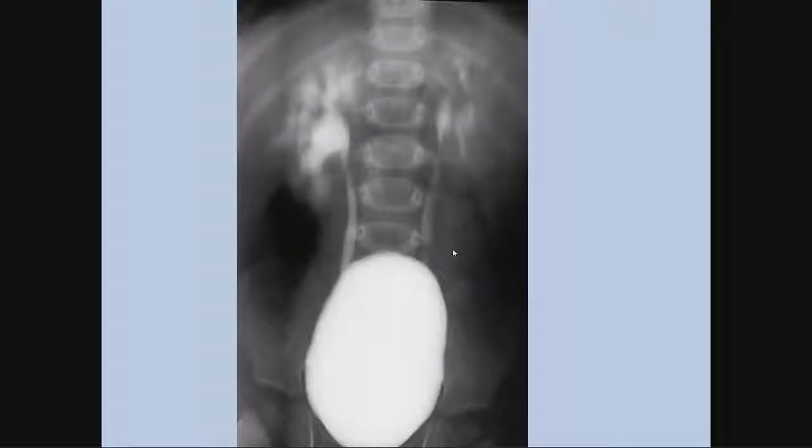And you can see there's reflux into both kidneys, but in the right kidney you can see there's intrarenal reflux as well. So the contrast is not only going into the calyces, but it's also going into the renal parenchyma. This is not covered in the international classification, and some workers feel this is a worse prognosis because if this system gets infected, it's more likely that the bugs will get through at sites of intrarenal reflux, but we have no way of reporting that on the international classification.